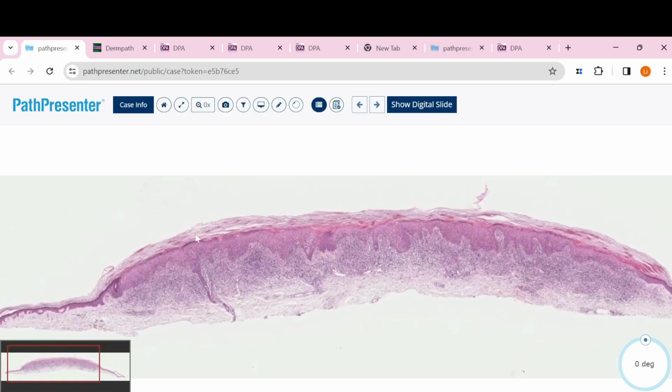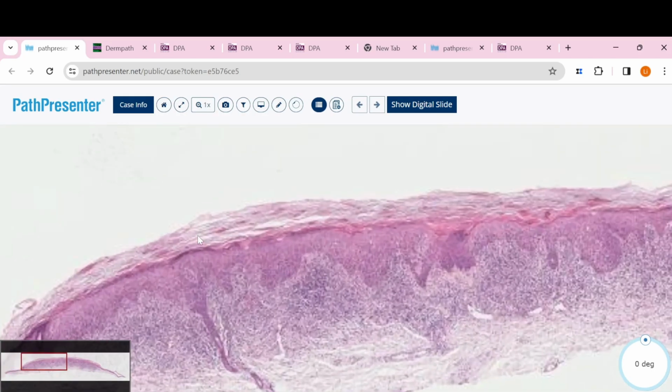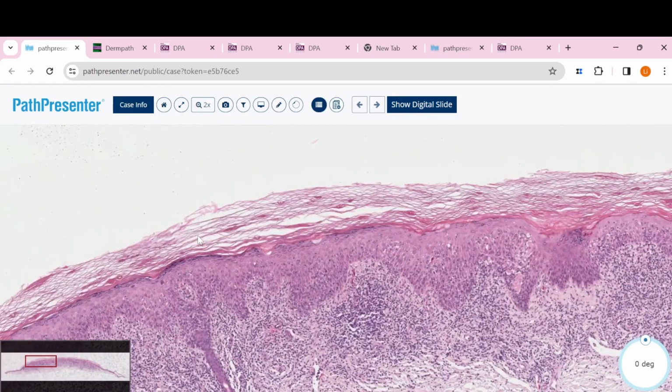And then let's zoom in to see some other features for lichen planus. One thing you need to bear in mind, BLK, that is benign lichenoid keratosis, and lichen planus usually in the microscope are identical. You just could not tell them apart usually. But one thing you can tell them apart, that is lichen planus. You can think of it like strict parents. They have really strict diagnostic criteria.